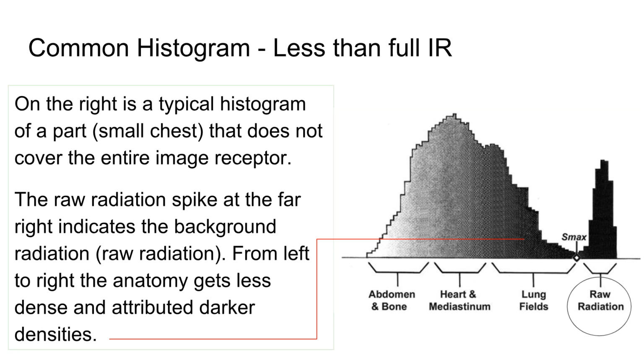Yes. So if you collimate on, let's say, a hand, but if you collimate like here, everything would be brighter. What can happen is if your field is open too much, let's say way past the tips of the fingers, that's going to cause a spike, that's raw radiation that the image received, still within the overall collimation, and it can cause the image to be too light.